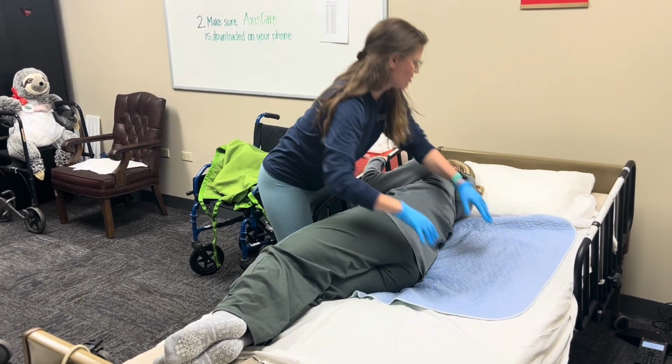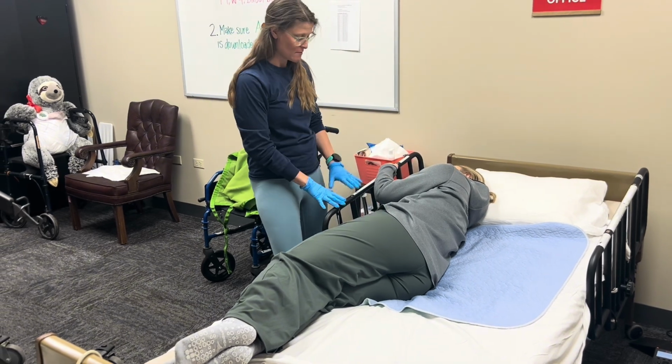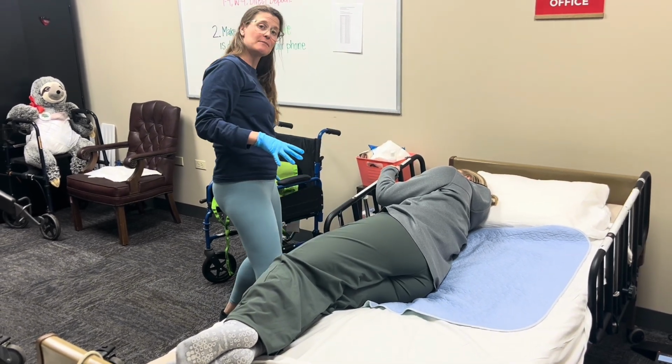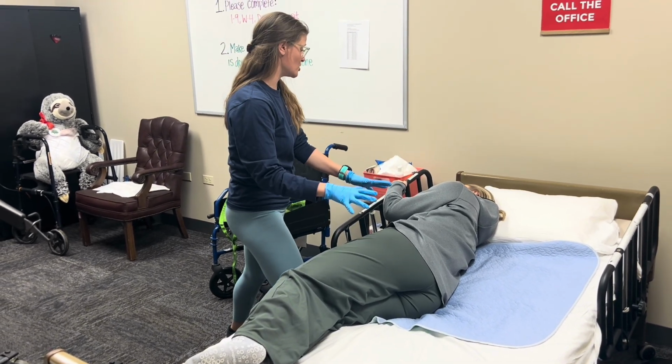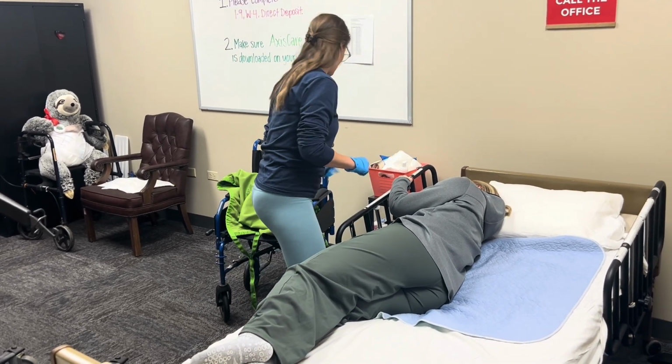So since I have our Hoyer sling, are you comfortable enough to be on this side right now? Yeah. Okay. So I'm standing really close. The bed rail is still up. I know that I can take a step to grab the sling because I am close enough and I'm watching you, okay? And you're also very stable. If you were very unstable, I would make sure that that sling is even closer, okay?